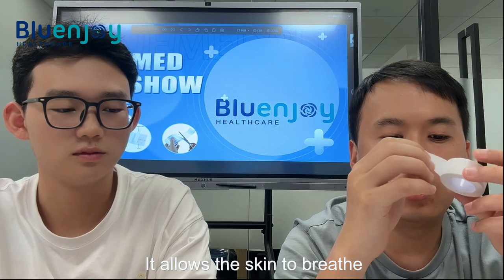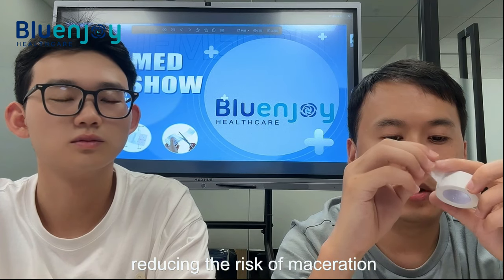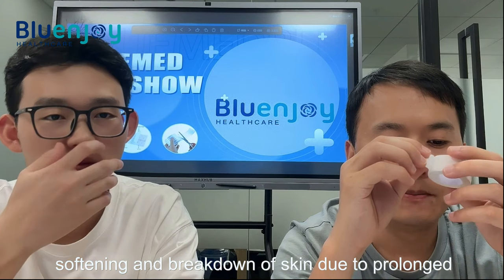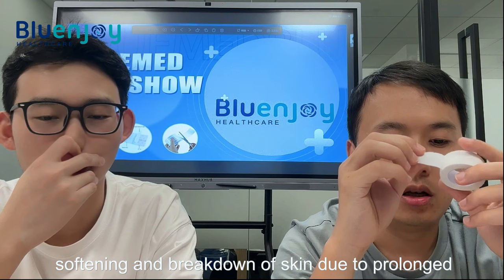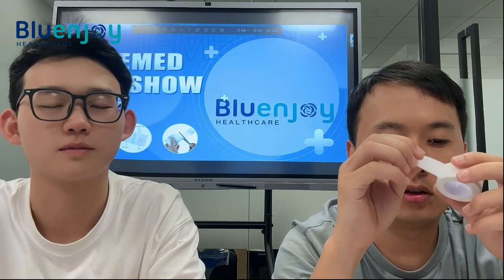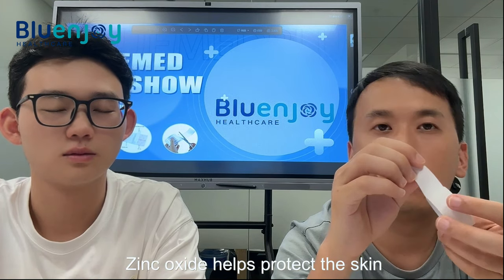Secondly, it is breathable. It allows the skin to breathe, reducing the risk of maceration — the softening and breakdown of skin due to prolonged moisture exposure.